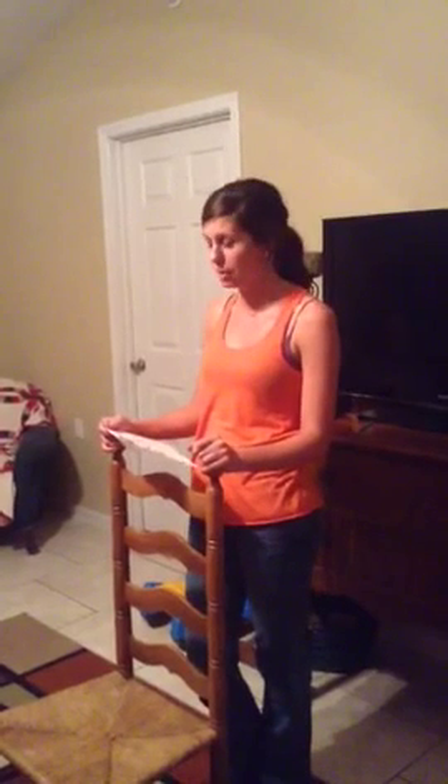My name is Tyra Newkirk and today I'll be demonstrating how to check your blood pressure manually. It is important and rather beneficial to know how to check someone's blood pressure manually.